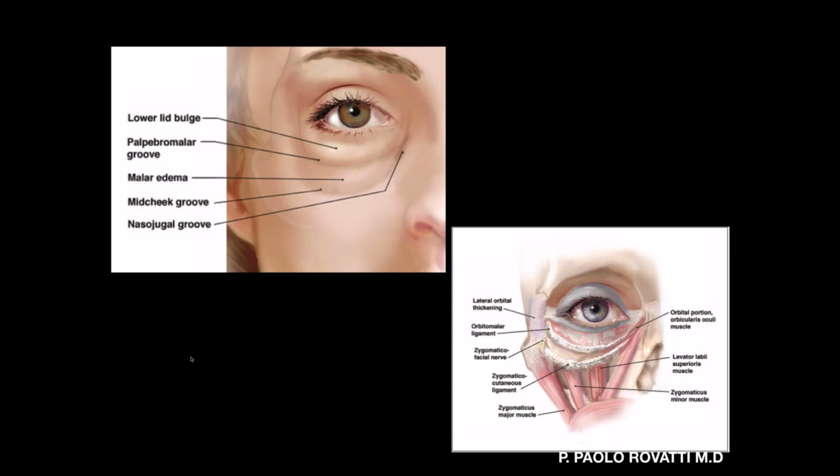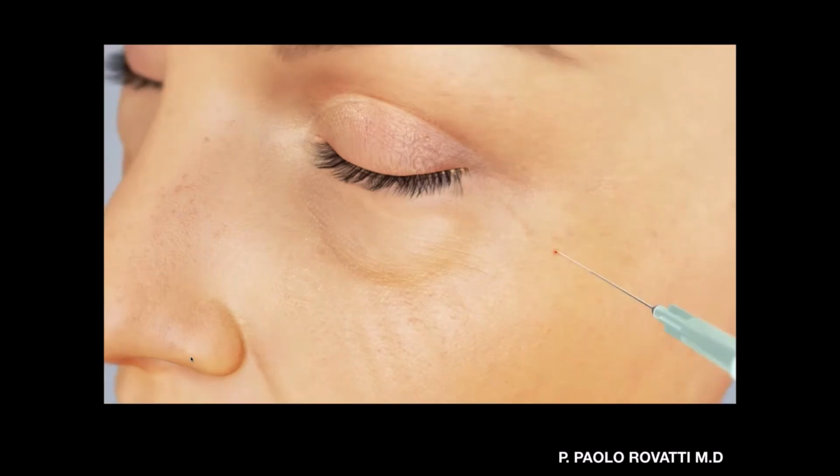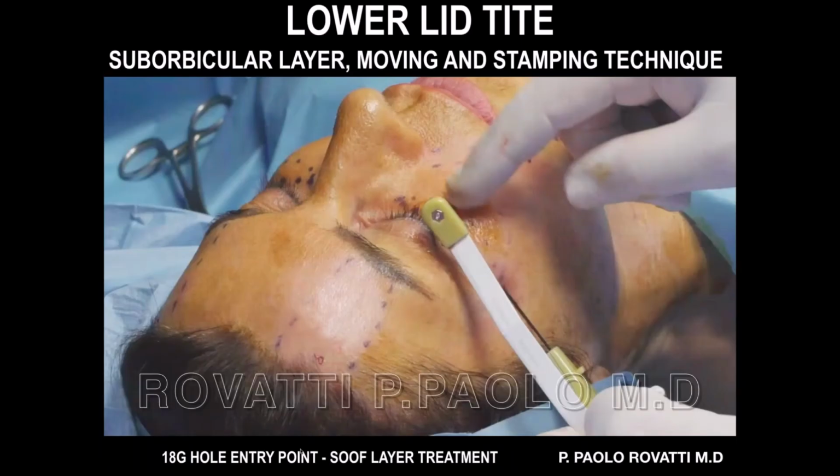So in this area. This is an animation, but I want to show you the anatomy better. We have lifted the orbicularis oculi muscle, and this is layer 1. And so we are going deep in the SOOF, and this is the SOOF where we need to treat. This is the area where you can have a contraction, a tightening of the fat tissue, and consequently, obviously, you have the skin tightened too. So now I want to show you the level at which we are working.